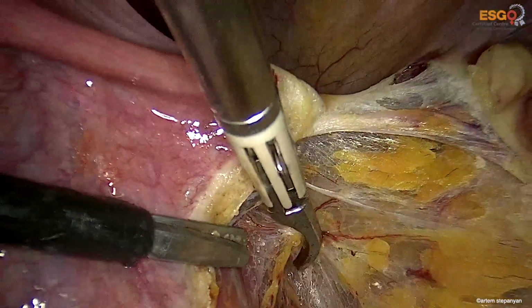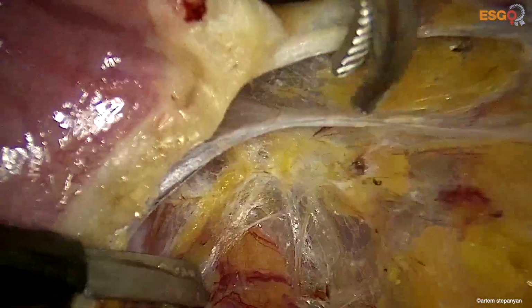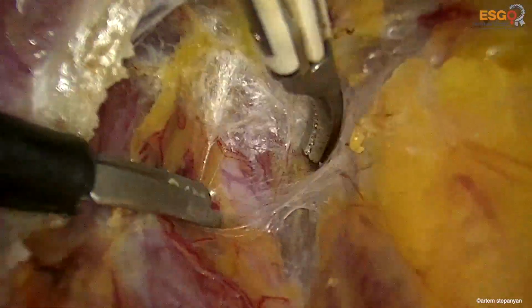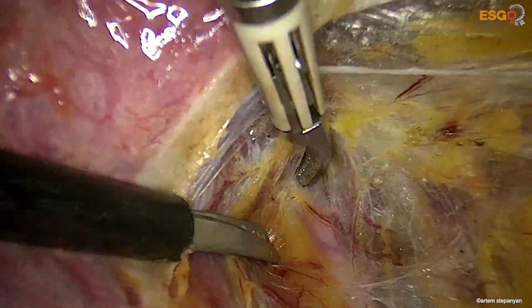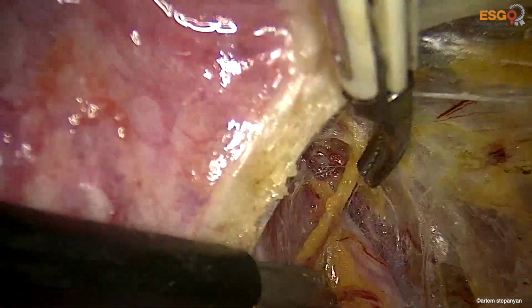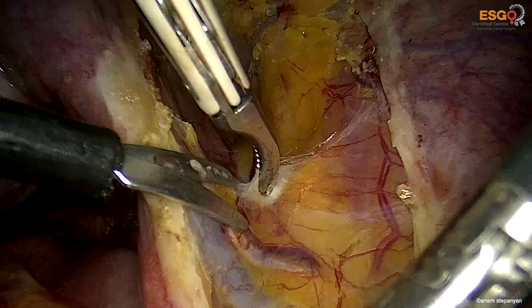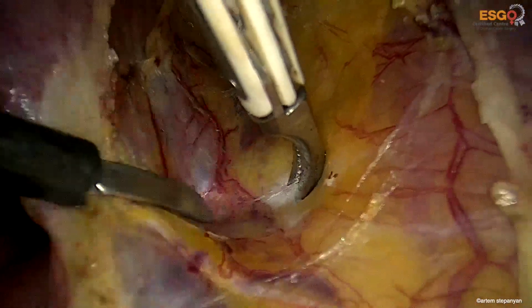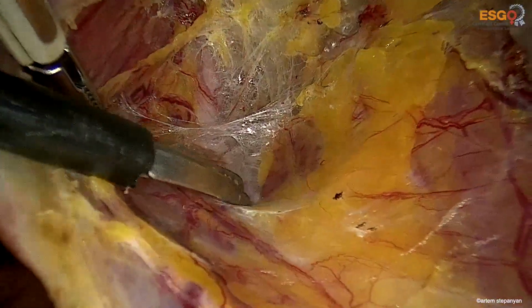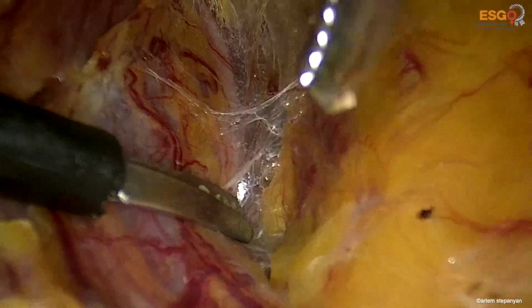Here, the right ureter is identified, and we proceed to coagulate and cut the loose areolar tissue surrounding the ureter to have a good visual control over that structure. And we continue detaching the posterior leaf of the broad ligament with the ureter.